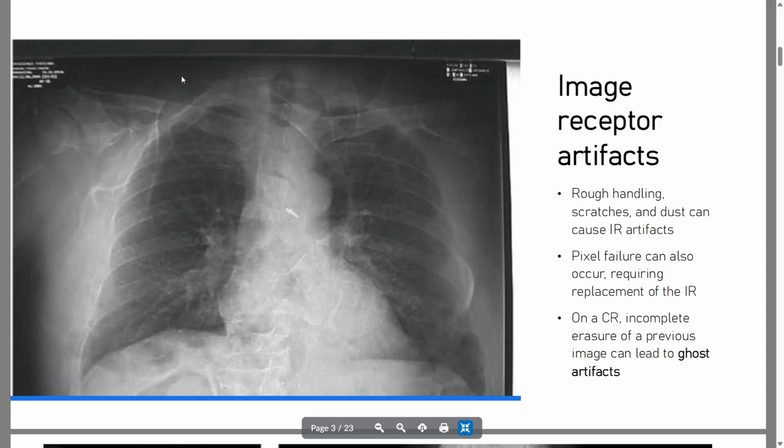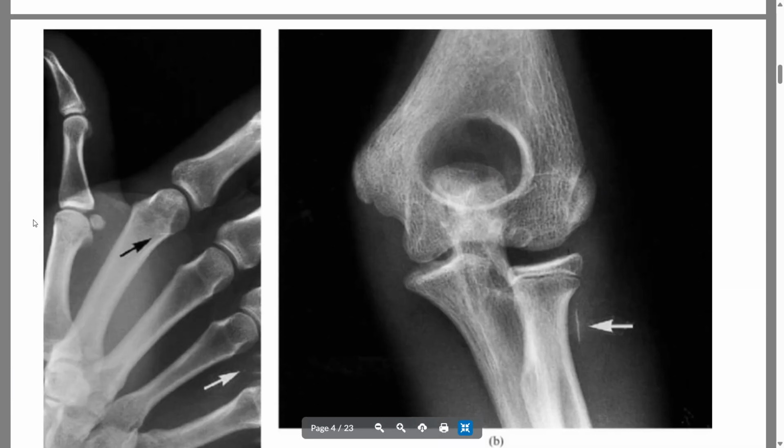So pelvis here on either side, the pelvic wings coming up this way. So at first glance, you're kind of looking at this side of the chest like, what is this weird radiopacity? But you can see that it is like that ghost artifact of a pelvis spookily superimposed over that chest.